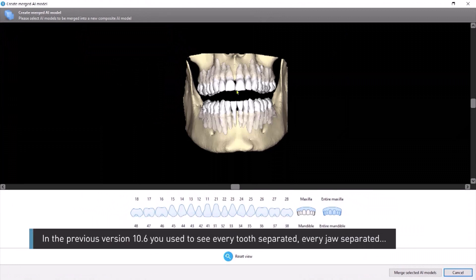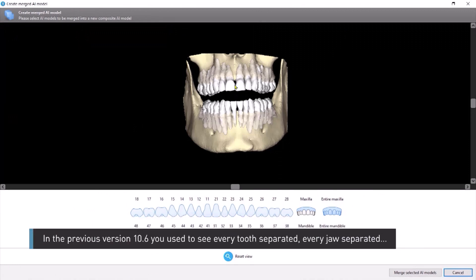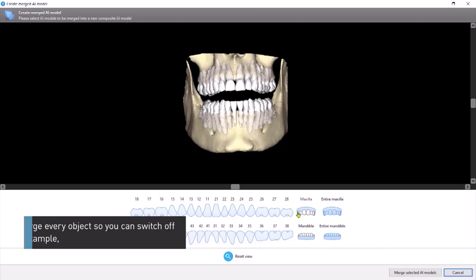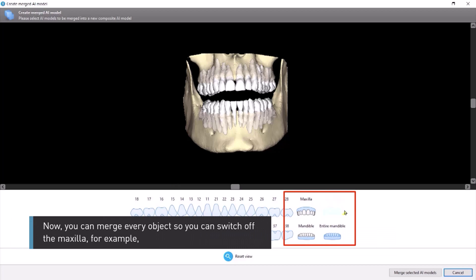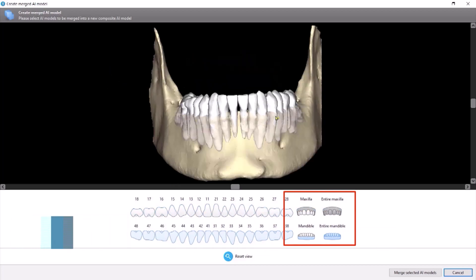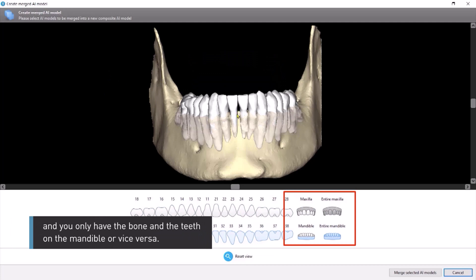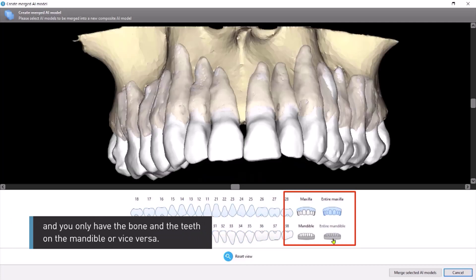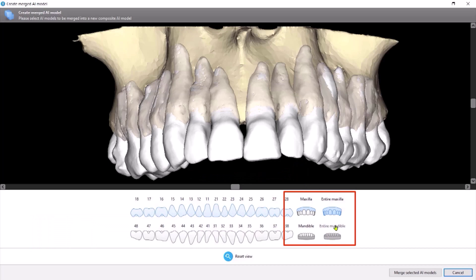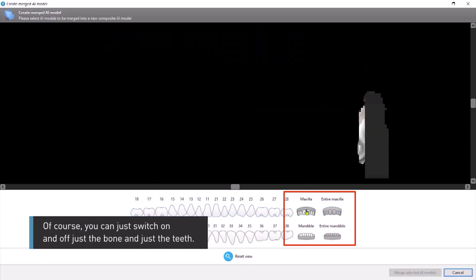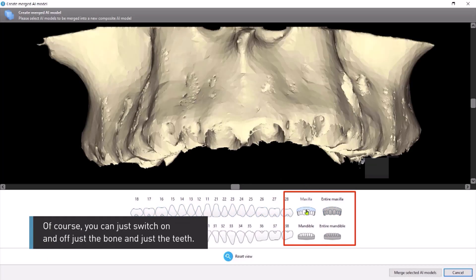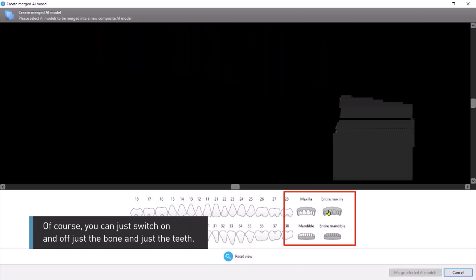In the previous version, 10.6, you used to see every tooth separated, every jaw separated. Now you can merge every object so you can switch off the maxilla, for example, and you only have the bone and the teeth on the mandible, or vice versa. Of course, you can just switch on and off just the bone or just the teeth.